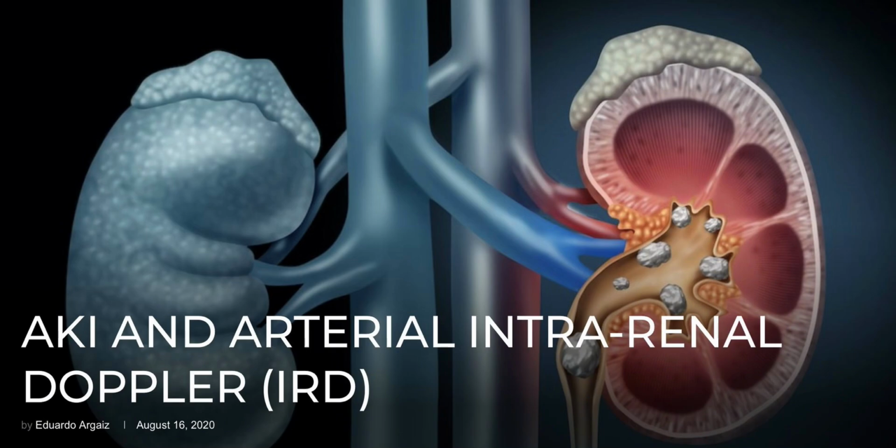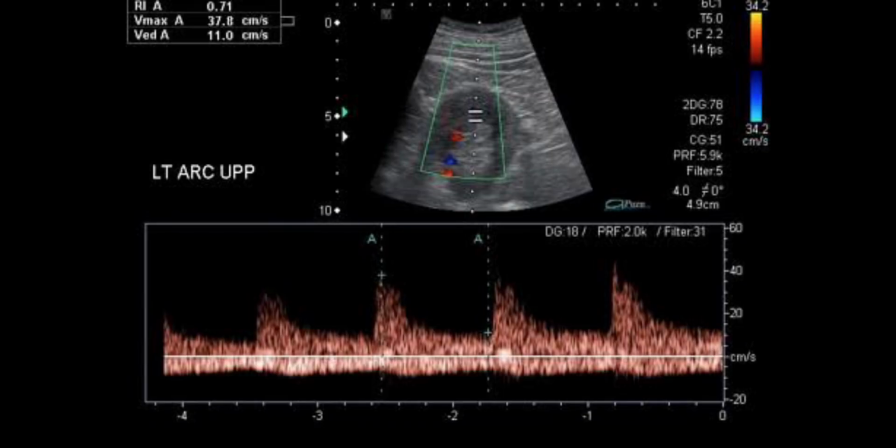Much of the time when you are calling your radiologist colleague to perform a Doppler ultrasound of a renal transplant patient, maybe on the first post-op day or second post-op day, and you are asking him about the collection, they give you a number on the ultrasound which we call the resistive index. What does this number mean and how is it derived?